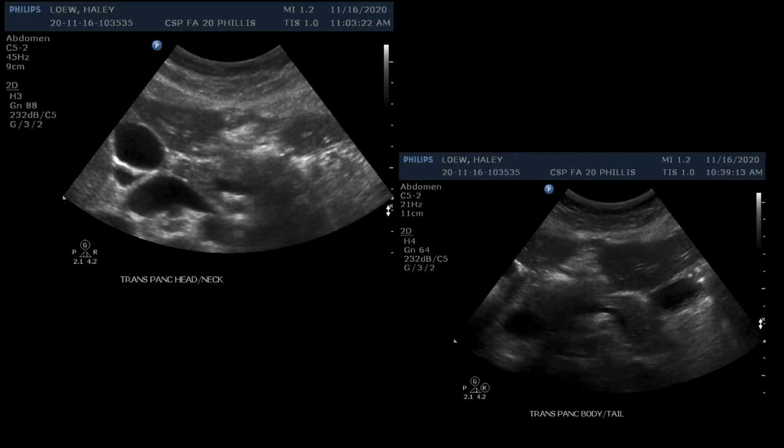The pancreas can sometimes be difficult to image. My head and neck picture is missing a visible GDA and CBD. However, these are not always able to be imaged. Following the splenic vein will guide you to find the tail of the pancreas. Gas was covering the head of the pancreas, but I could have turned my probe more to 7 o'clock to show more of the tail.